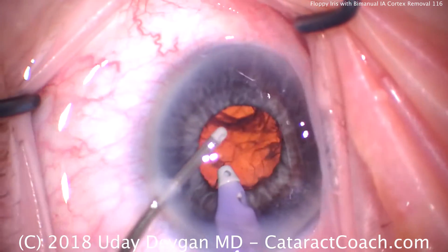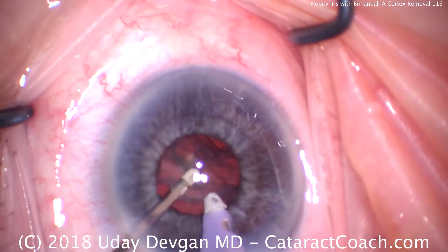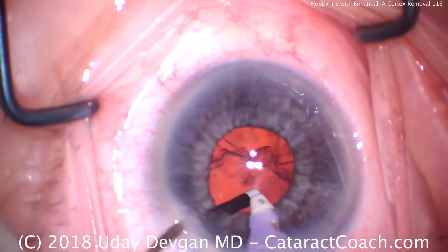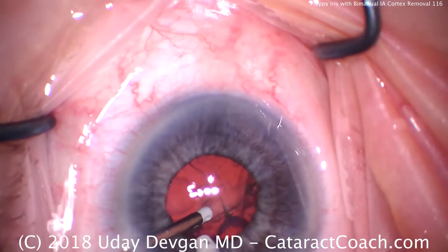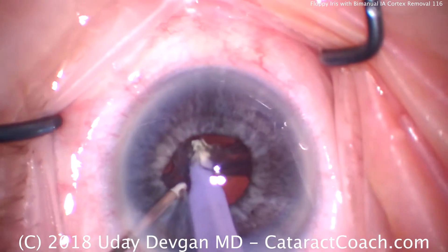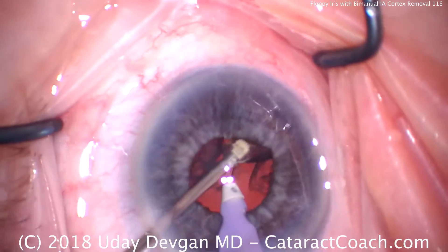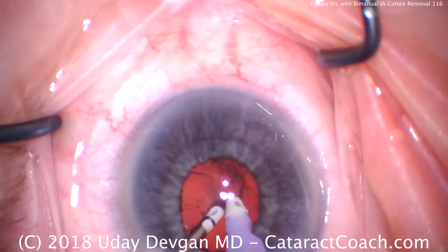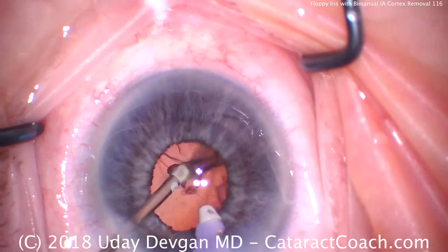Taking our time to get that piece of cortex — it's a big epinuclear shell. There it is; that whole shell comes up. That looks excellent. Most of it's up now; we've got to get the remainder. Trying to find an edge to hold and bring it up. Using the second hand just to help lift. Inadvertently grabbing the iris — be careful with that. Once we get that big epinuclear shell out, that's a lot cleaner.